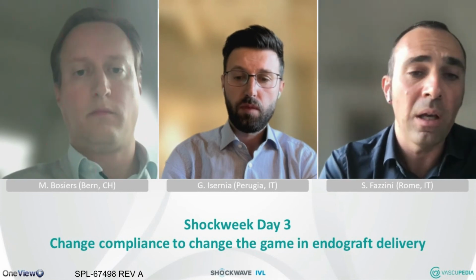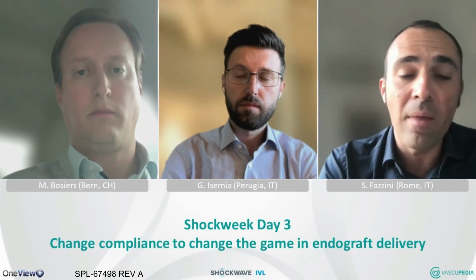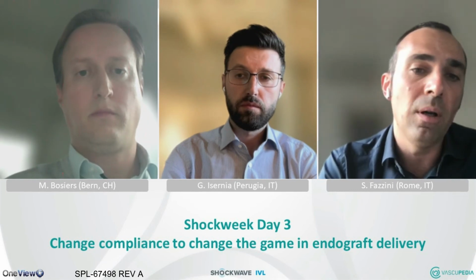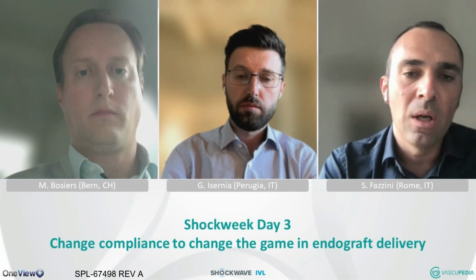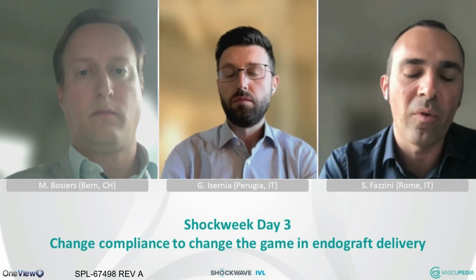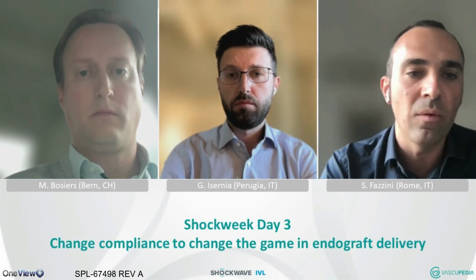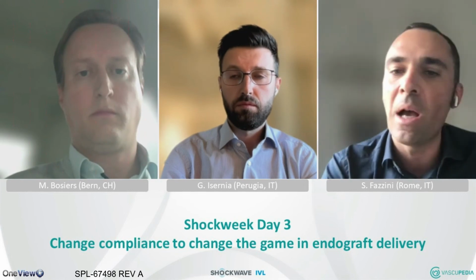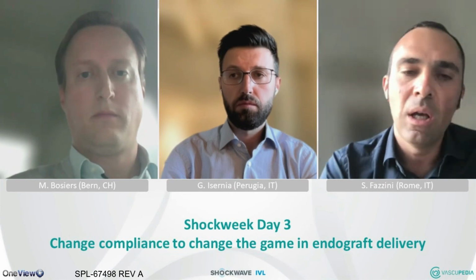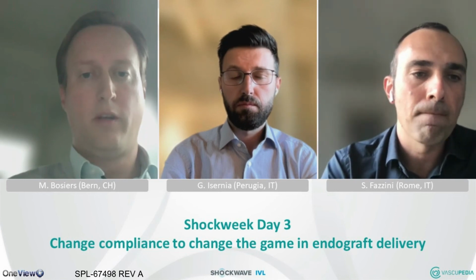And I think it's also important not only to guarantee a better solution for the procedure, but also to guarantee a better iliac expansion for our iliac limbs, and also to avoid the stenting below. As mentioned by Giacomo, it's very important to keep the hypogastric arteries patent for many reasons, for peripheral reasons, for spinal cord ischemia. It's like the profunda for the peripheral. So it's very, very important to keep the hypogastric open. Fully agree, Stefano, fully agree.